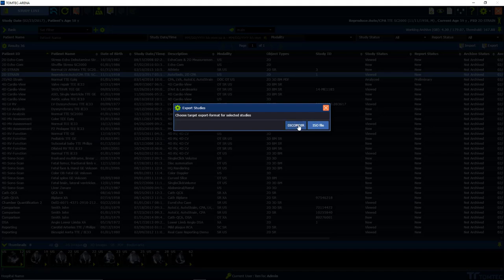Choose the target export format for selected studies. You can decide between a DICOM-DIR file and a so-called ISO file.